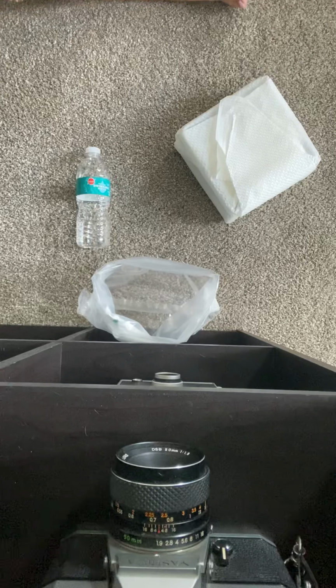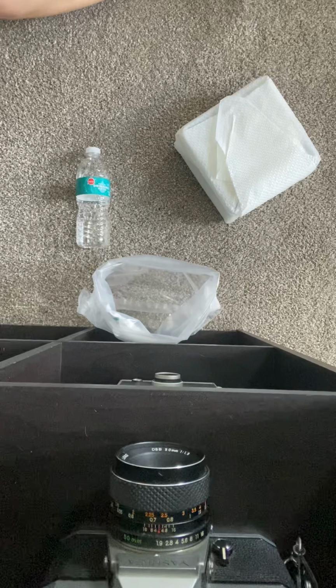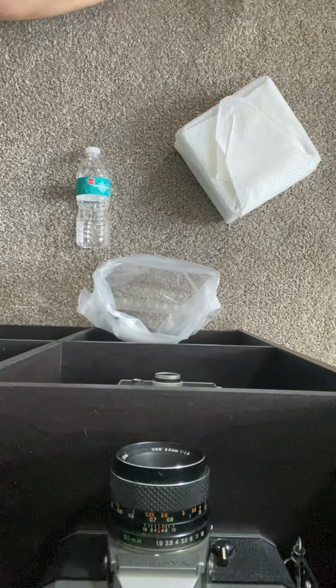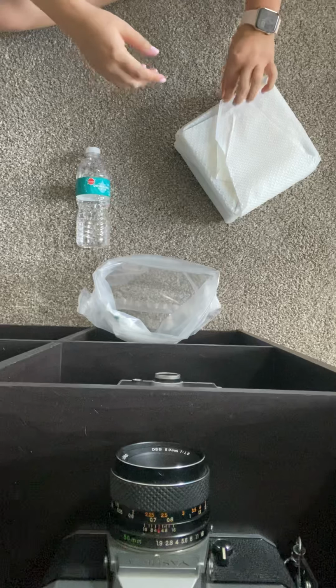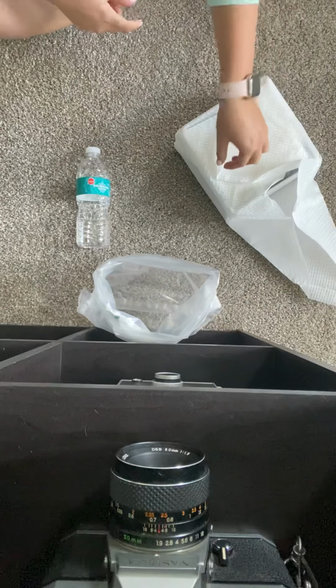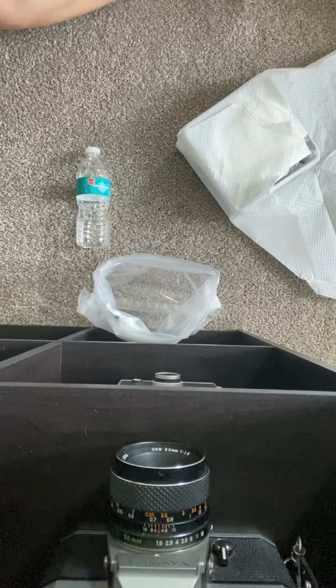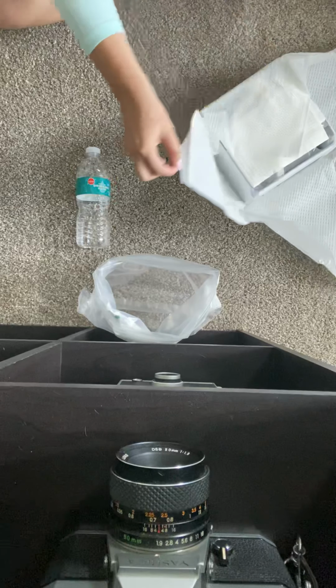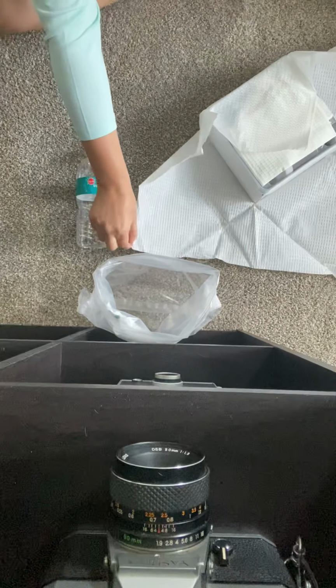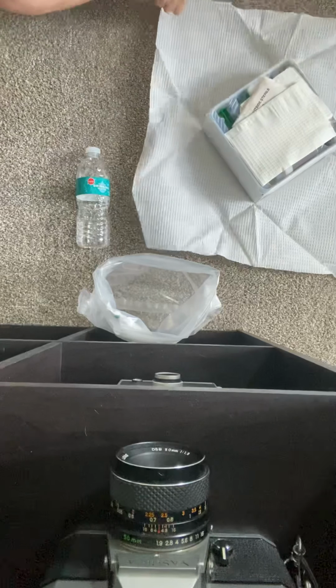Okay, so what I'm going to do is open up my kit. The first flap is going to go away from me, and I'm going to note that 1-inch border. Then I'm going to scoot this over, because I don't want to touch my water bottle, my patient side. And then lastly, I'm going to do this one.